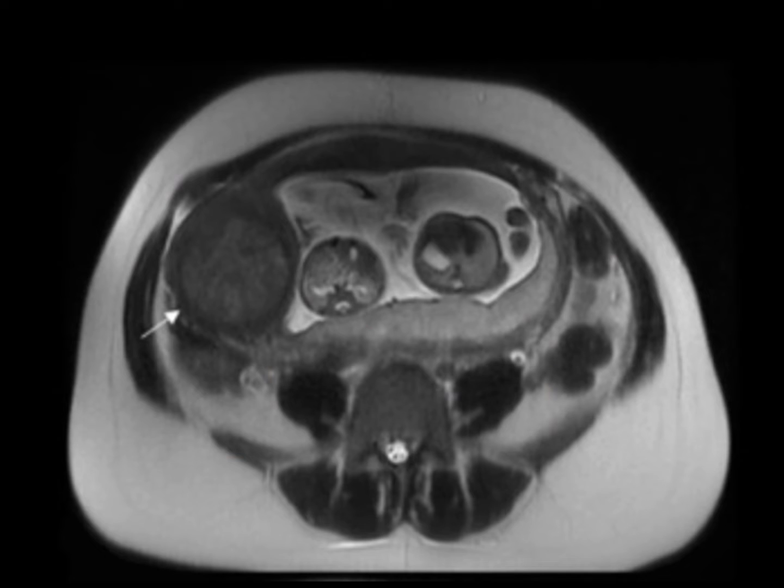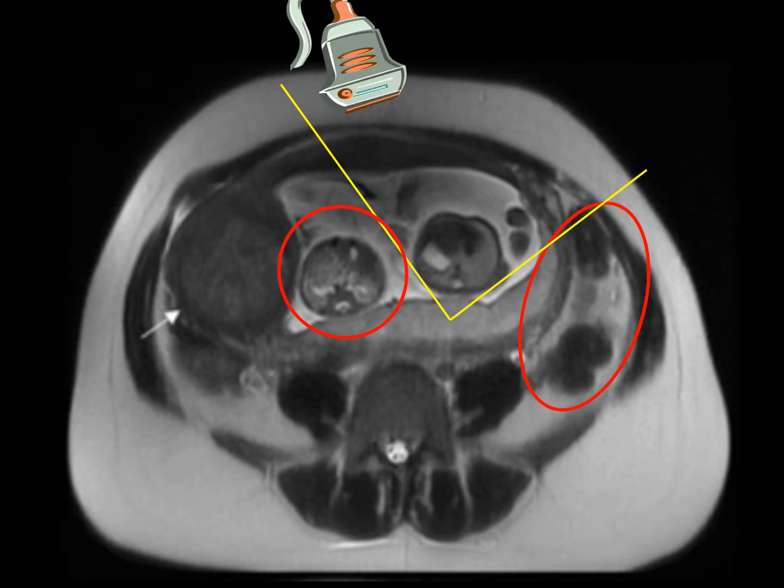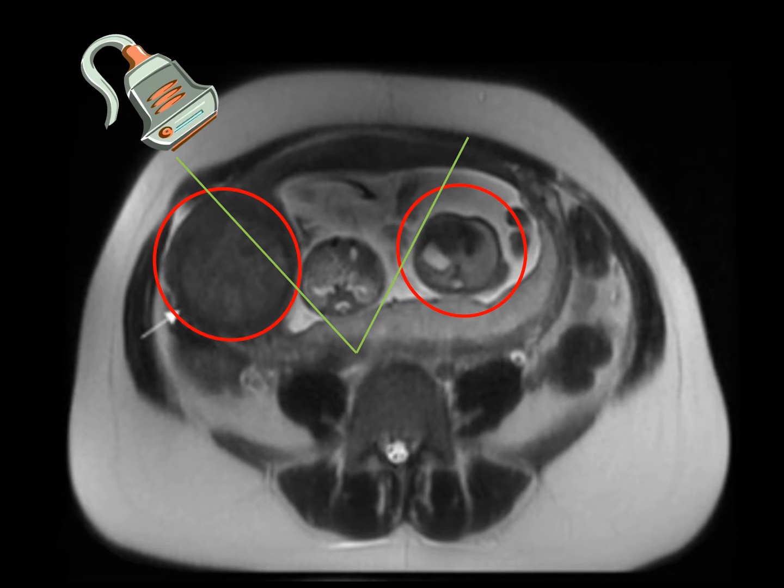Now you can see the difference between the singleton and the twin pregnancy here, same view, and what we have is the same limiting factors, except on the other side of fetus A, which is on the maternal left, you can see the other fetus, and this greatly limits the amount of imaging for each of the fetuses. Now, the other fetus is also limited by the first fetus, but also by this large fibroid in the right aspect of the maternal uterus.